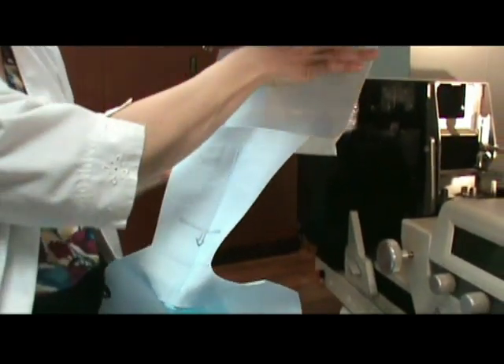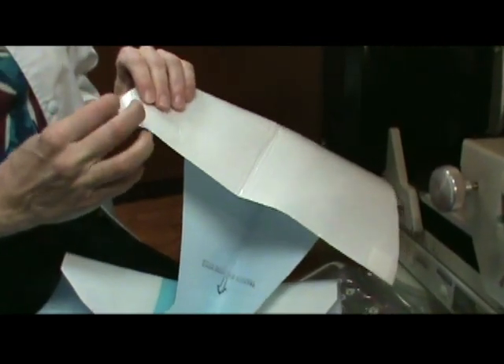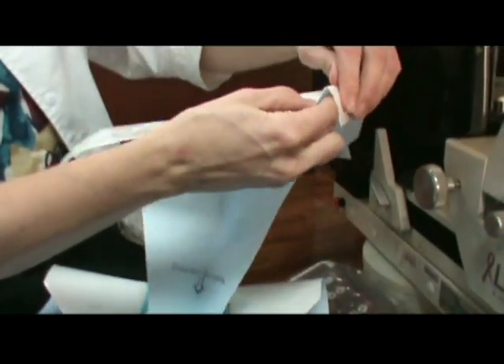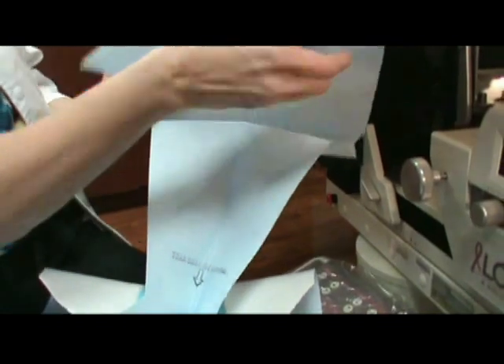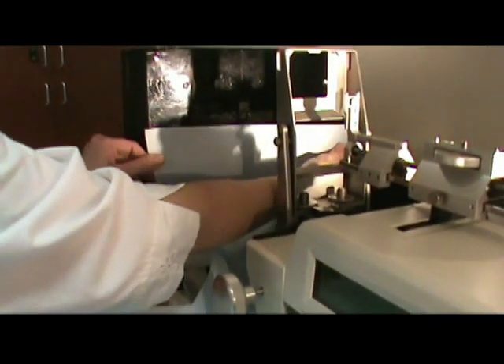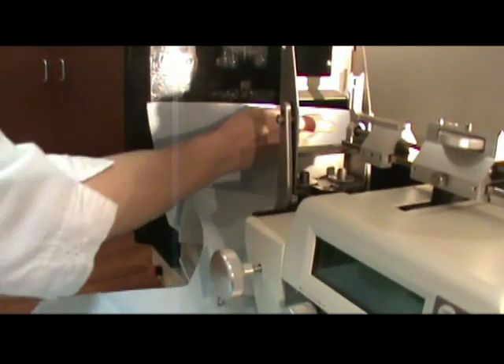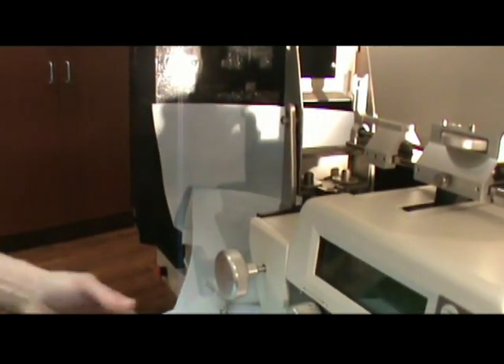With this V portion right here, you'll notice on the back there are two sticky tabs — we're going to remove those. On this particular drape we're going to go down midway to where it'd be out of the way of the imaging for the breast itself.